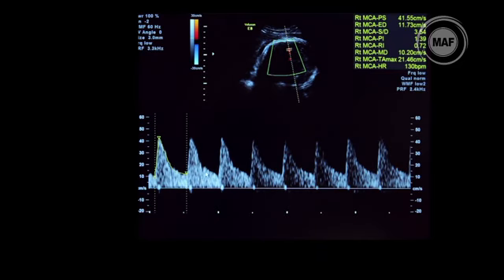Yeah? In an abnormal baby, this one increases, so this value becomes lower. Okay, in the umbilical artery, it gets bigger, so it's a reverse thing. So in here you want to see a high number. In the umbilical artery that we did, we want to see a low number. Okay, so if it's a high number in the umbilical artery and a low number here, then the baby is being compromised. Okay, so that again is a normal trace.